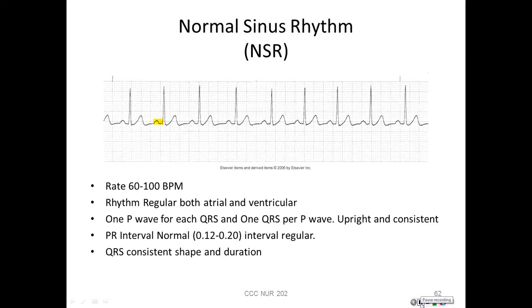We're going to be talking about cardiac dysrhythmias. You've already had a chance to review the basics of reading a rhythm strip. You looked at what a P wave, QRS, and T wave look like, the length of the P wave, the PR interval, the length of a QRS, and the ways to check rate and rhythm. All of those are part of one that has been published already in our Integrity series.